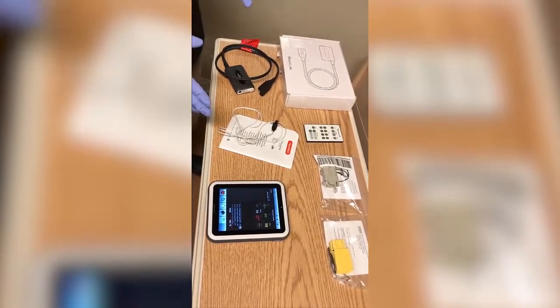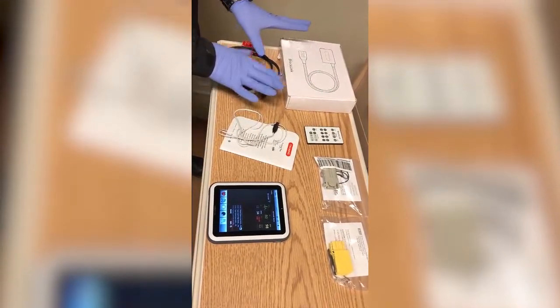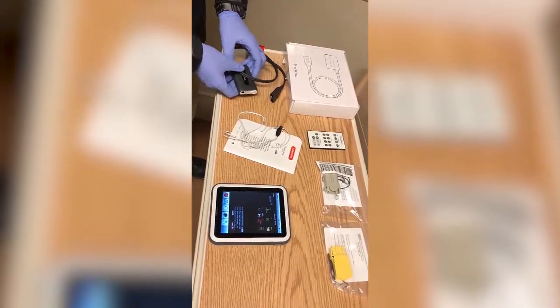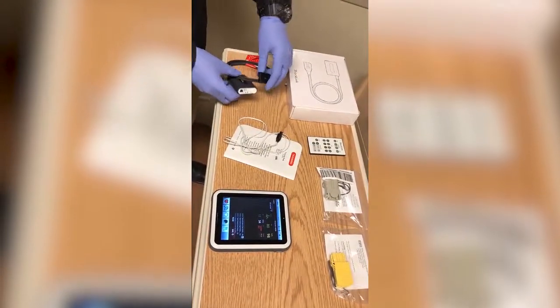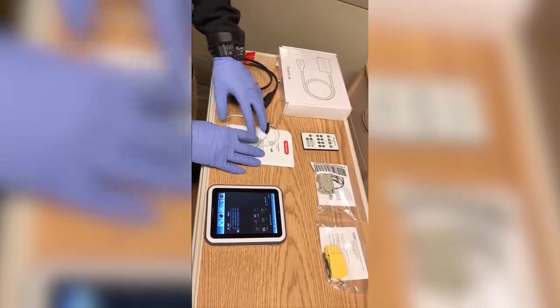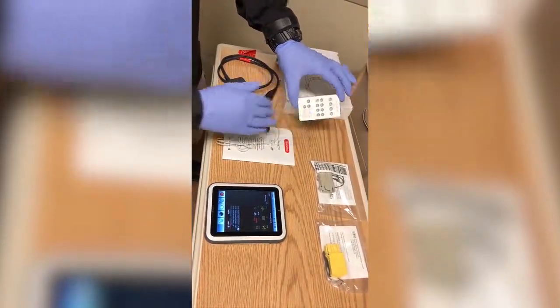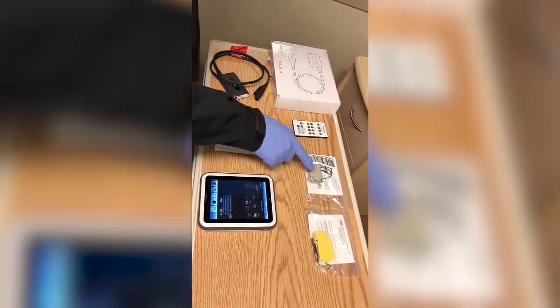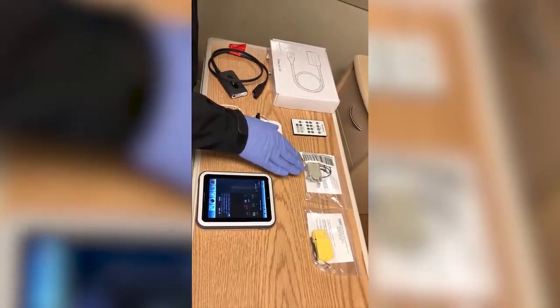If you're going to defibrillate your mannequin during the course of the scenario, you'll need the shock link system with the contents from this box. Included in the box is a shock link system, training pads, the remote which you don't need to use, and an additional spot — or in this box may be the adapter if you're using the LifePak or Zoll defibrillator monitors.